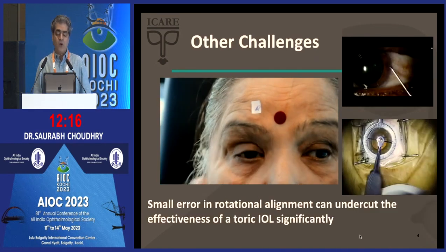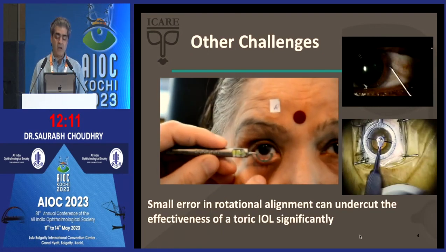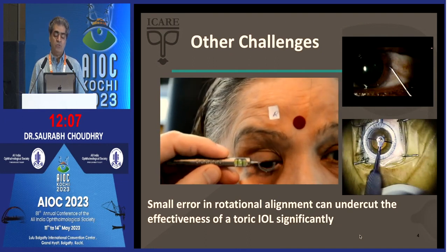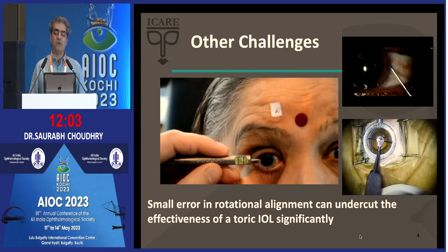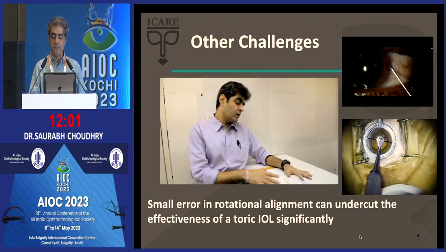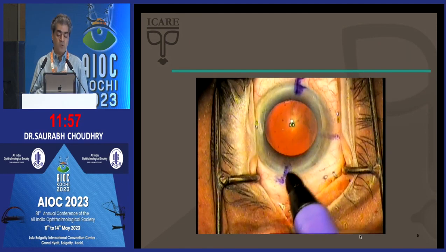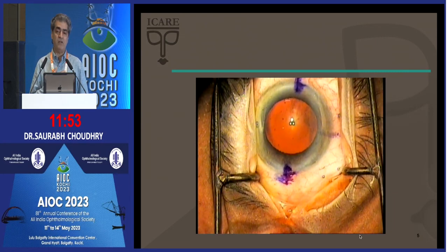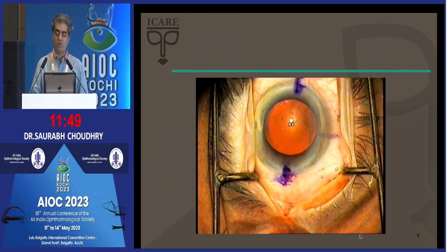There can be a small error. Let's suppose this patient we're trying to do is very apprehensive about getting the metal very close to her eye, so she's blinking all the time. What we land up with is imperfect marks, where the patient is moving all the time. So these are the marks we got, and the surgeon is trying to make them straight. Now he lands up with these smudged marks, which will lead to compromised results.